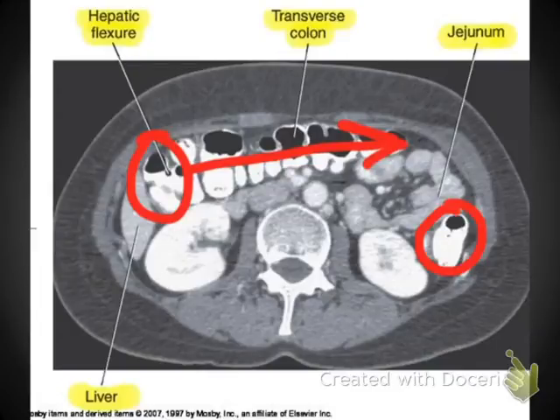And so that's just something to keep in mind. The transverse colon is always going to be your most anterior portion of the colon, and it's going to look on supine the most superior. And it's what helps create this frame. It's one of the sections of the large intestine that very rarely people will not be able to distinguish because it has just a certain look to it.